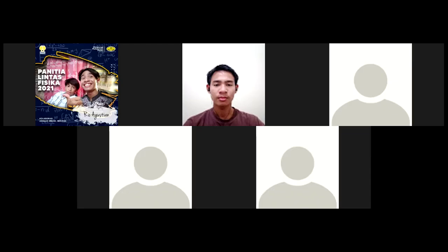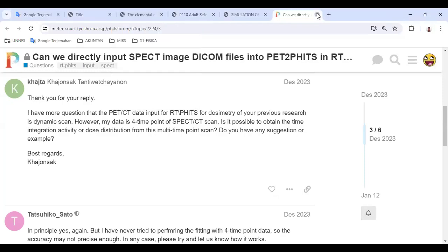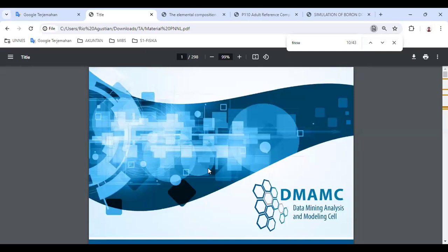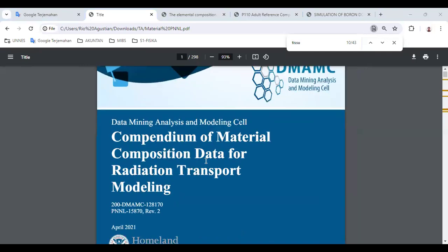Yes, so the first question that Mr. Zahid is asking is about the composition, if I'm not mistaken. So yes, we have several references about the compositions. For general reference, we use this reference. I'm going to give the link later after the video.